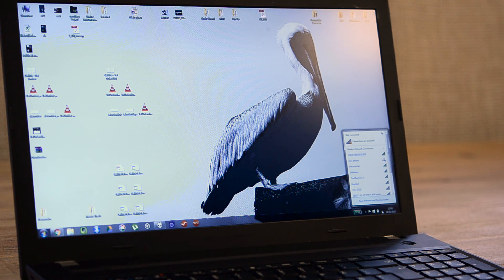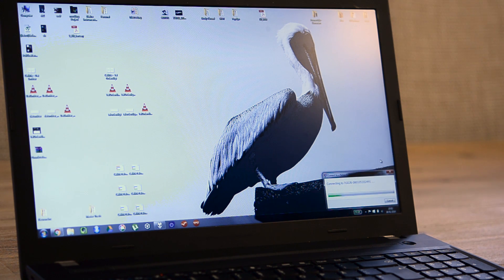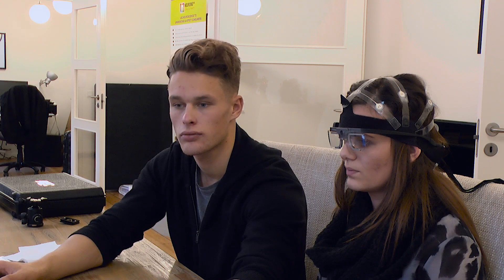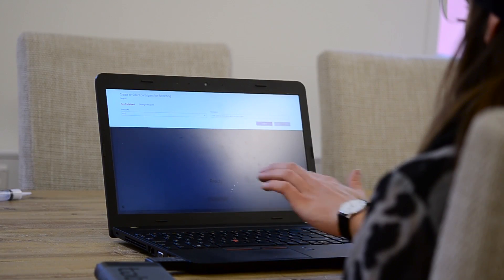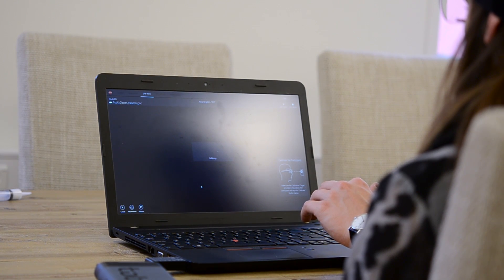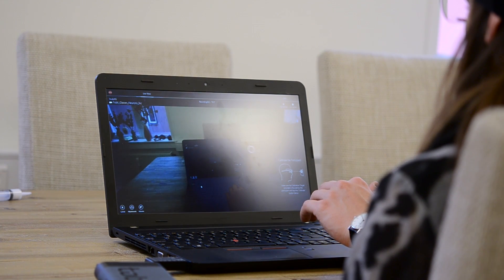Now that the EEG is set up and ready, the last step is to set up our eye tracking device. In order to do so, we first connect it wirelessly to our computer. Once that is connected, we are ready to start the software. And with the software up and running, all we need to do is to calibrate the device, so that we can start recording knowing where exactly the participant is looking at any time.